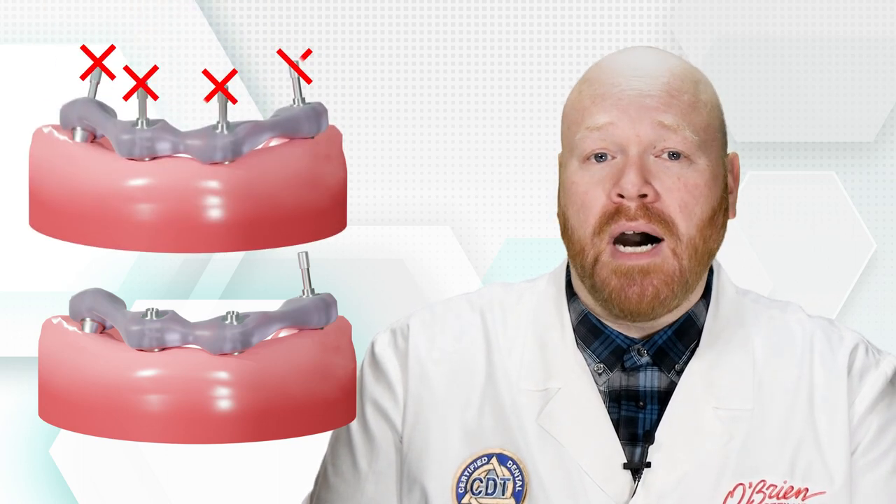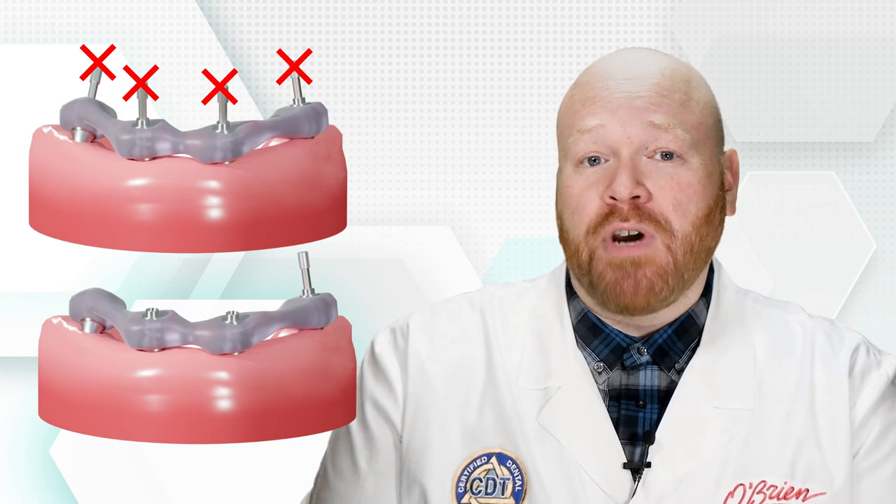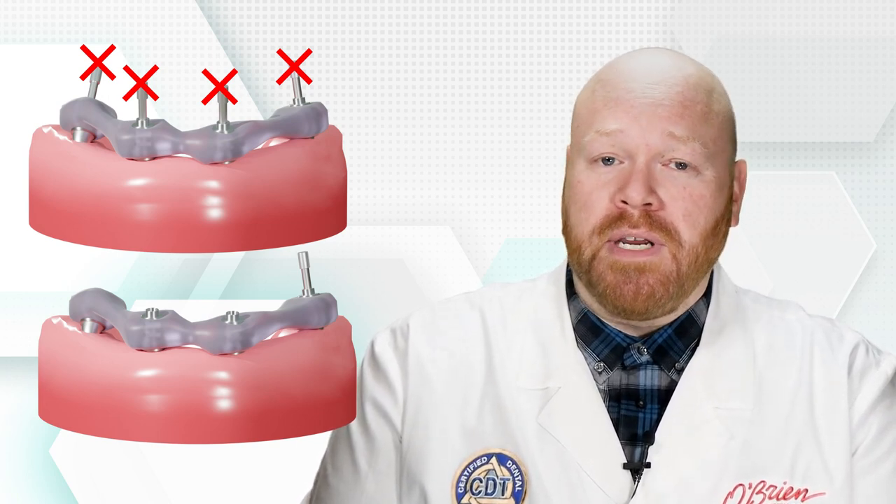So how do you avoid that? Well, it's actually pretty straightforward. When seating the jig to the implants, you'll always use just one screw. Securing the jig with multiple screws at the same time is what can cause the acrylic to flex. Sometimes the discrepancy is small enough that you don't see or feel the flex as you're securing the screws.